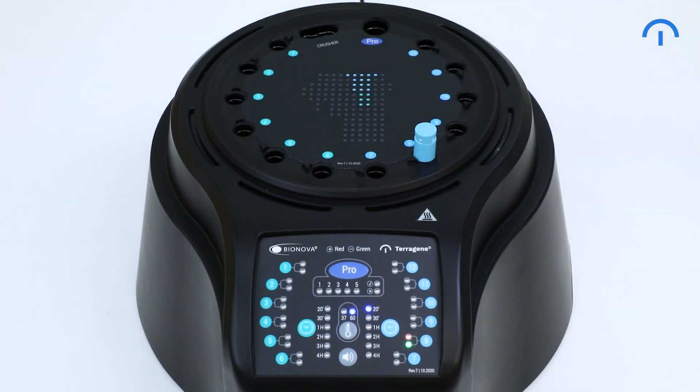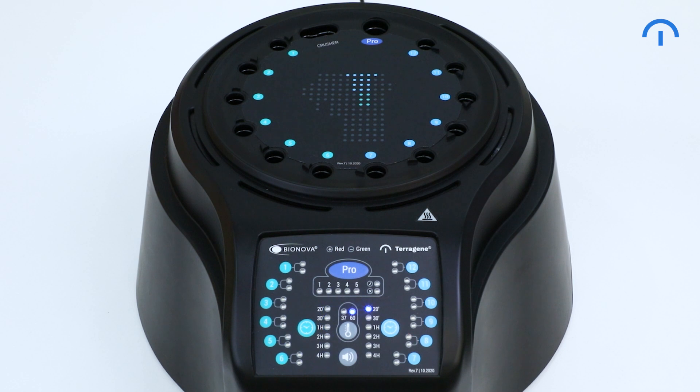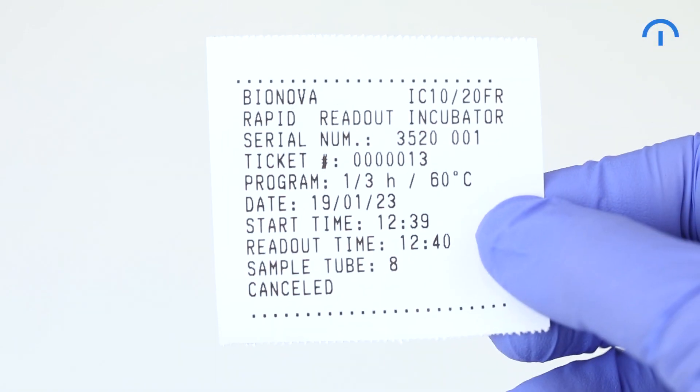Once the reading is in progress, if you take out a biological indicator from the position, an alarm will be triggered. If you put the biological indicator back in the position within 10 seconds, the reading will continue. If you don't, the alarm will stop after 10 seconds and the autoreader will print a cancellation ticket.